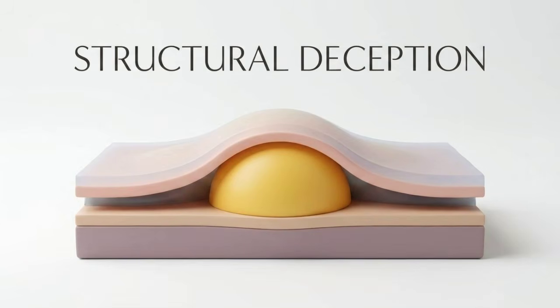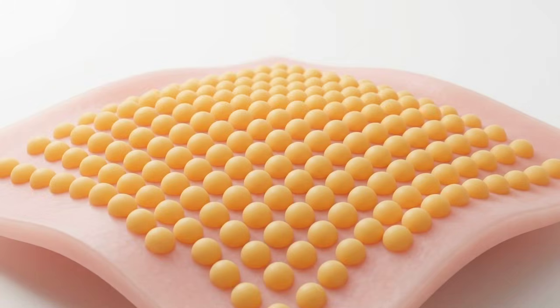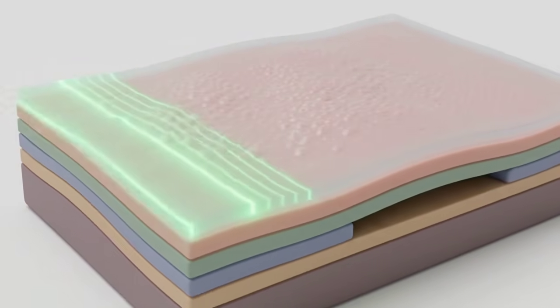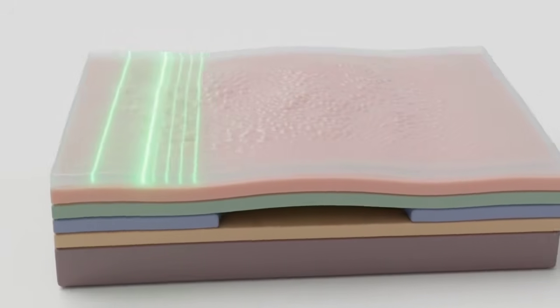This brings us to the most deceptive mimic of all, the inherited drusen phenotypes. The presence of actual drusen on an exam does not guarantee a diagnosis of standard AMD. Consider cuticular drusen. Clinically, this presents as highly symmetrical, densely packed, small round drusen, typically in patients aged 40 to 60. Differentiating this specific condition requires optical coherence tomography, or OCT, to closely analyze the physical architecture of the deposits.